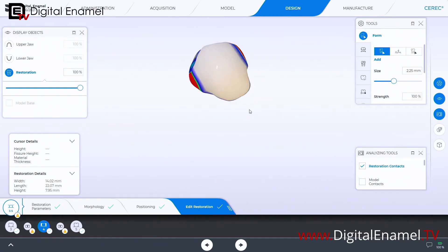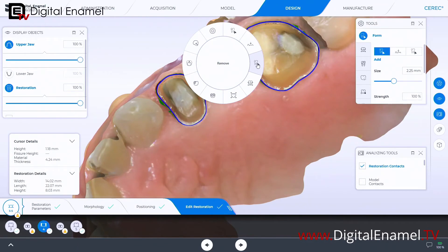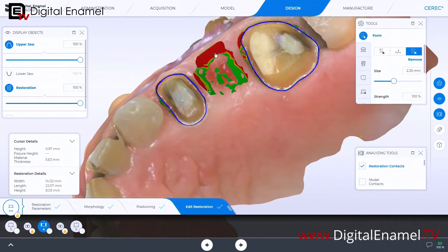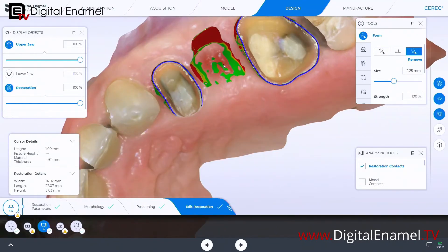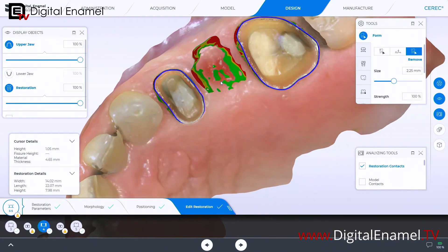I always say CEREC is a process, not a product. Don't feel like you have to make this exactly perfect. I'd rather get it in the milling unit fast, knowing I'll polish some things back afterward. Let me get this a little more pointy — now we're starting to look like we've got a zenith there. Now turn the upper jaw back on at full strength and use the remove tool to start punching this back, but the problem is you start to lose tissue contact in this zone, so you have to do it in increments.